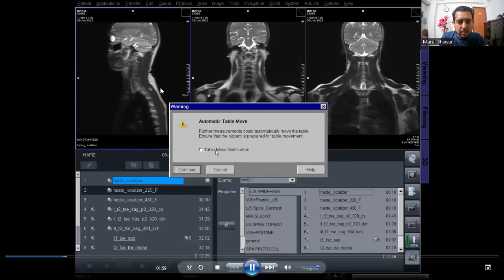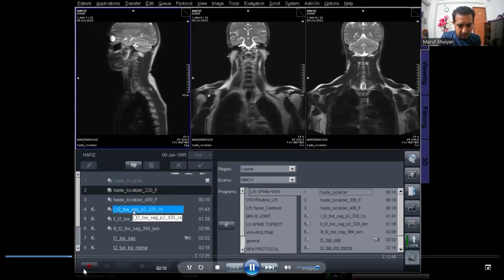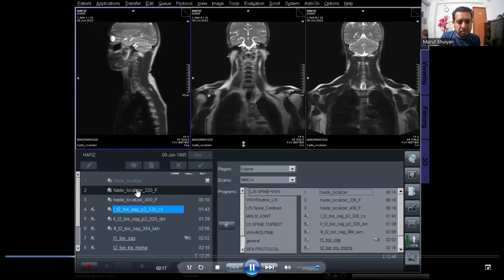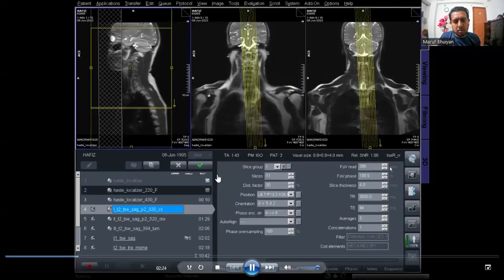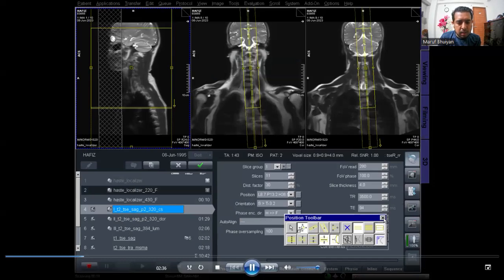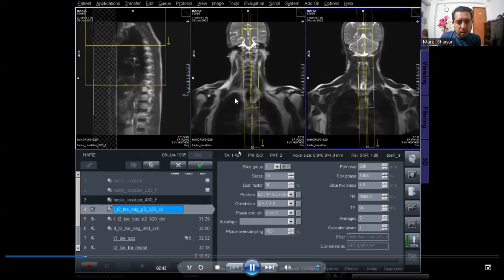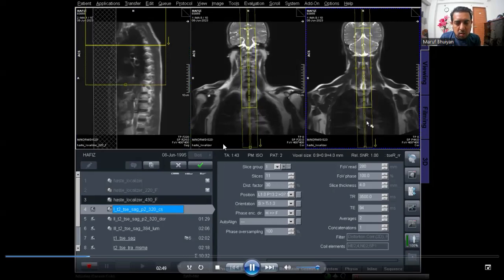The cervical localizer scan has been completed and the cervical localizer image is shown. Always look at this corner to see what's happening in the scanner. Now the dorsal localizer is scanning. If this cell limit notification comes, always keep it on the normal mode. I am planning for the whole spine first — we take the whole spine first and then plan the lumbar spine. For the whole spine, we plan the cervical spine, dorsal spine, and lumbar spine, and these three spines compose together to make a whole spine.